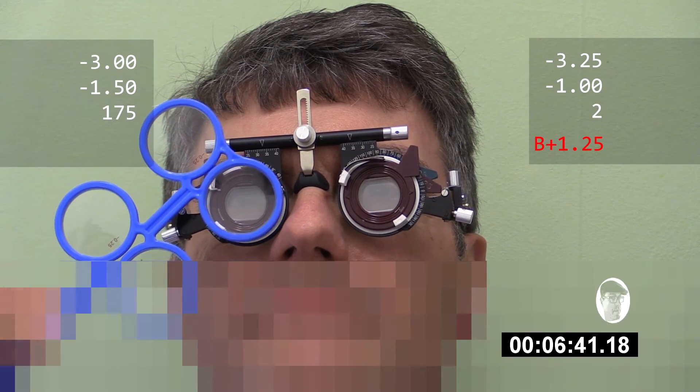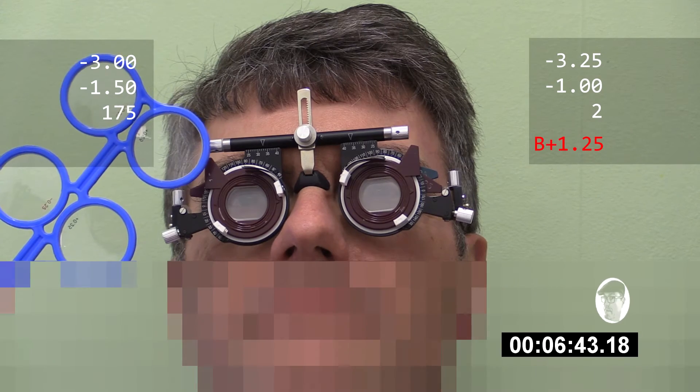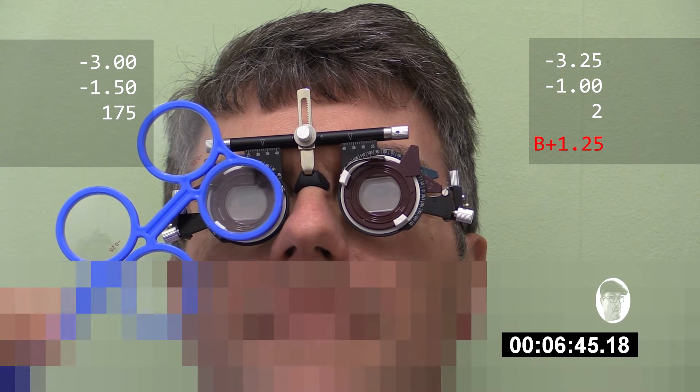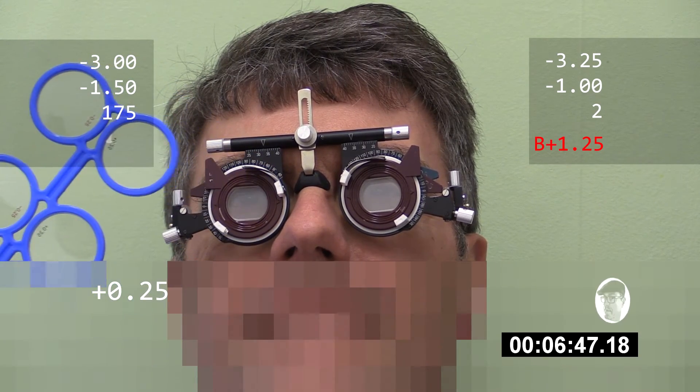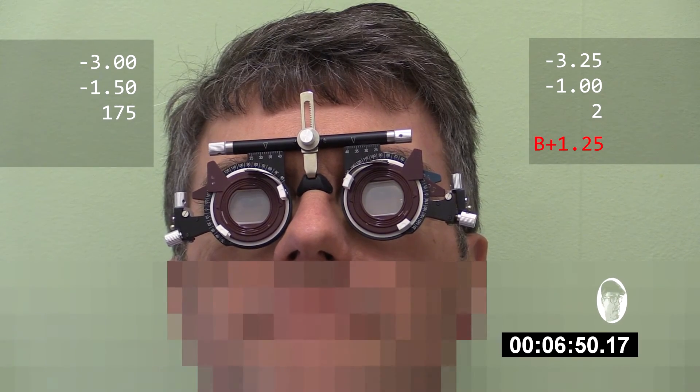And with that lens, the same, or without. And again. With, the same, without. Without. Without. Perfect.